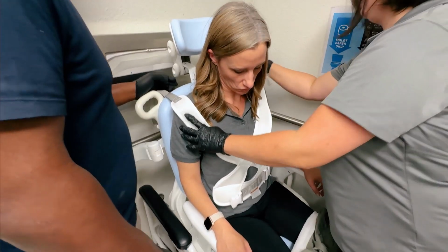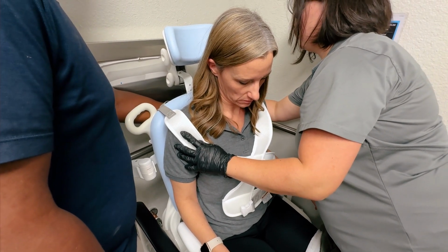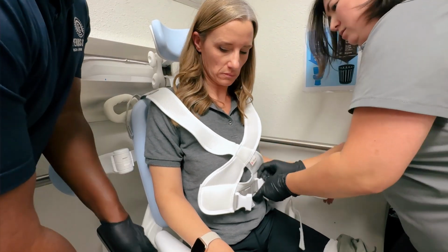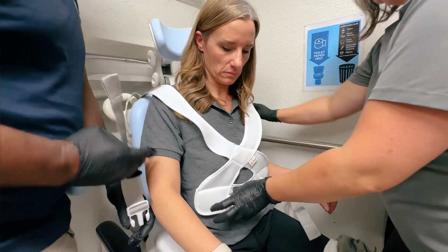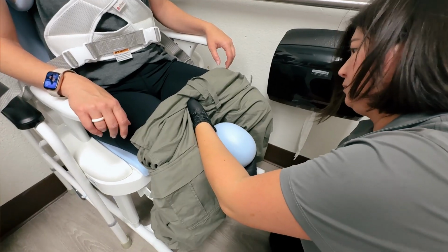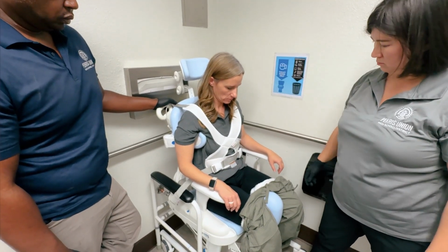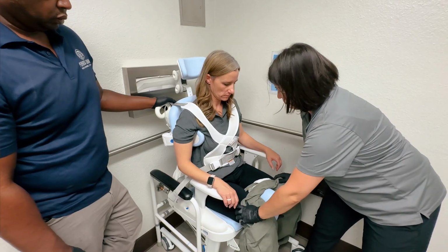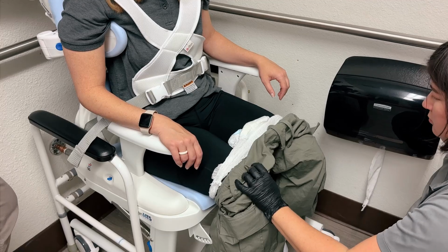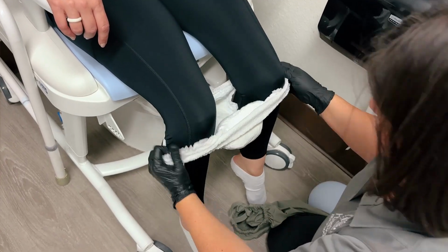Fasten the seat belt and other support accessories of the adaptive toilet seat to the student. Lower pants and absorbent brief further down towards the knees. If the brief is soiled, remove it at this time and dispose of it properly in the trash.